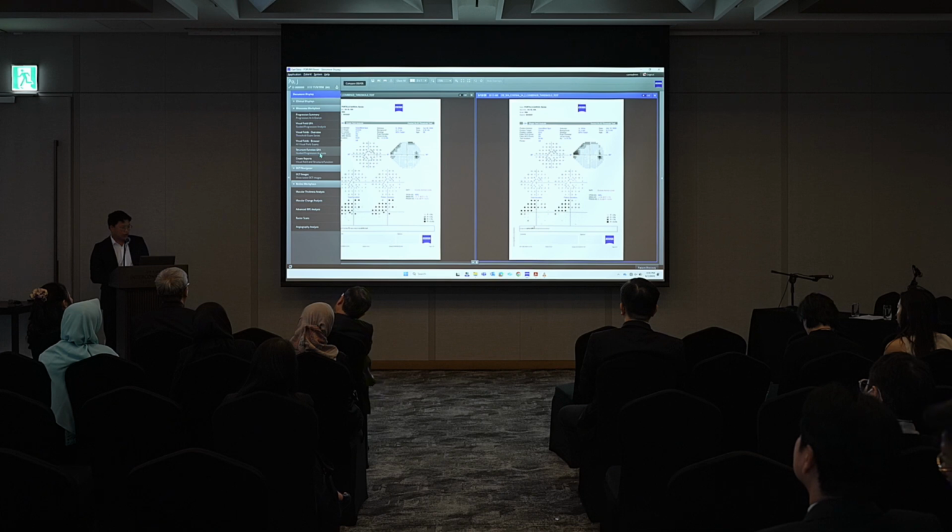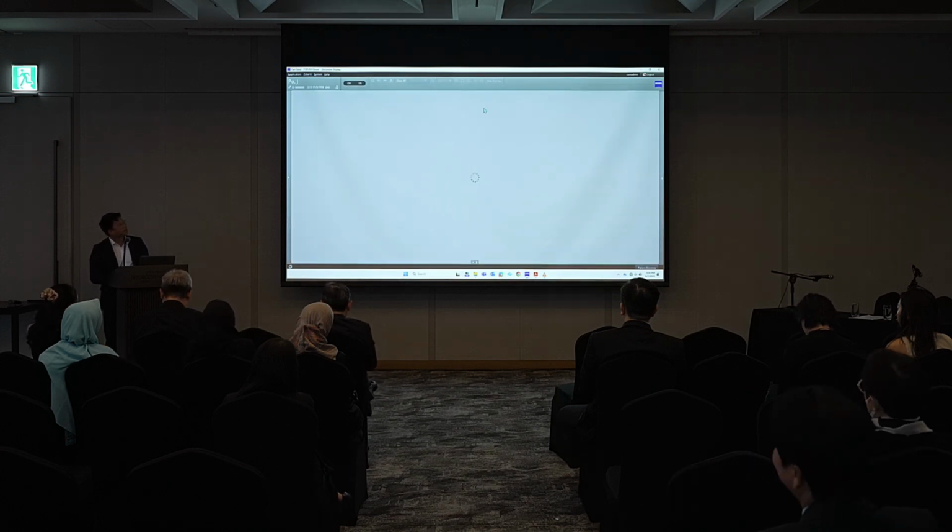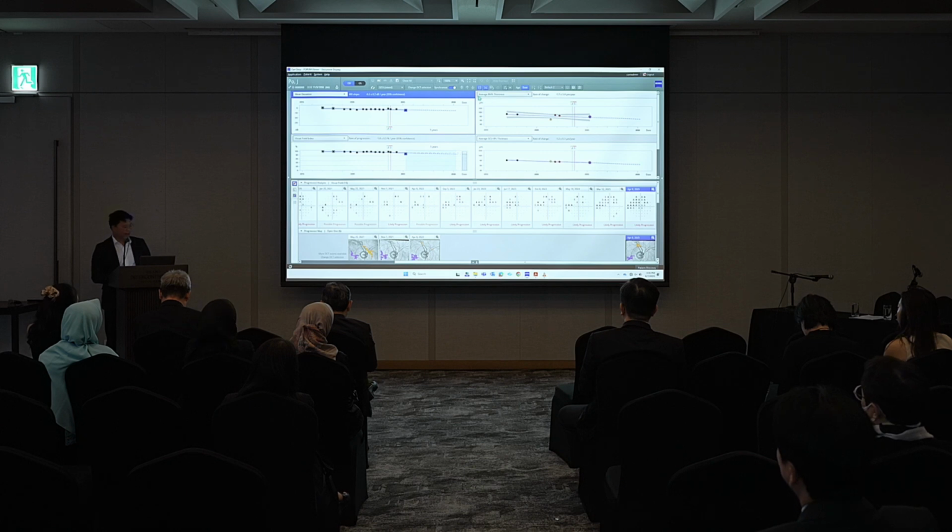So is this glaucoma getting worse? Under the Patients tab, the most powerful thing for me, just forget everything else. If you're going to click one thing, you just click on the structure function GPA. Okay, and so here's that live demonstration of the patient.